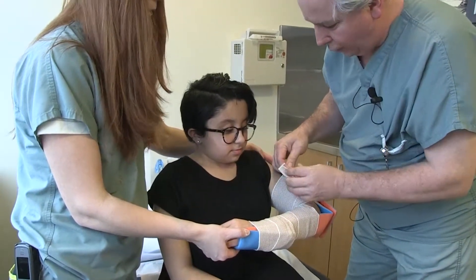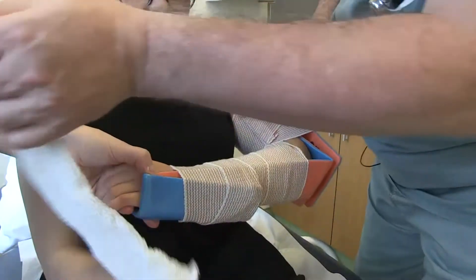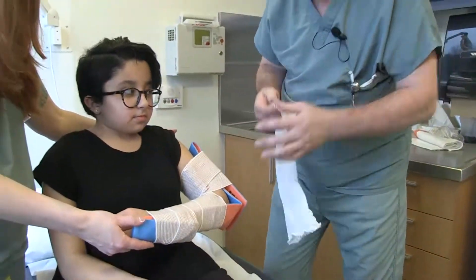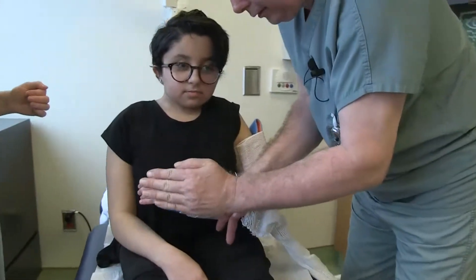We will knead the mesh. Once that's installed, we could use the mesh to hold it all together. You could pull back your arm. 90 degrees angle. The arm is neutral. The fingers are exposed.